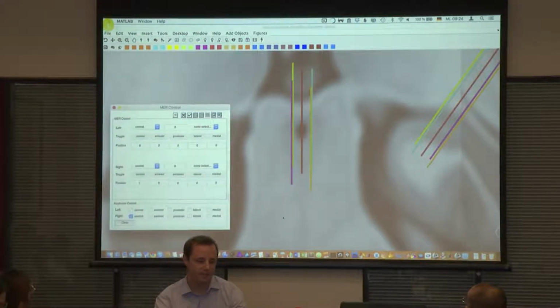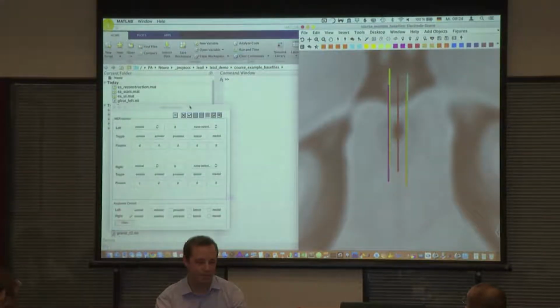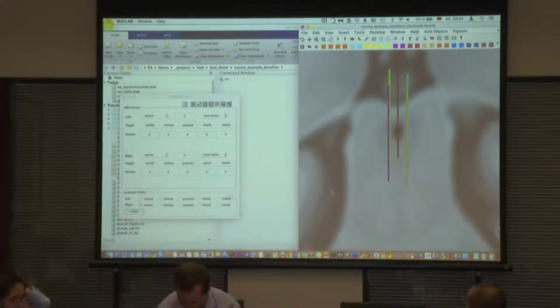And we see, let's do it like that. If we move this, we also see here that the position moved, right? Do you see that? Now we are at 4 millimeters before target.